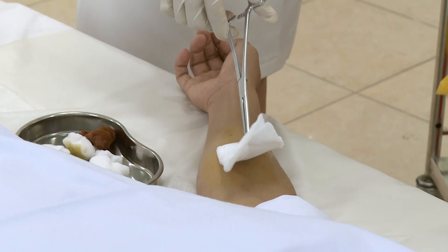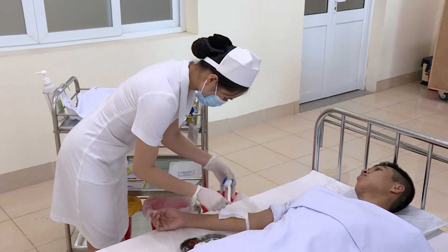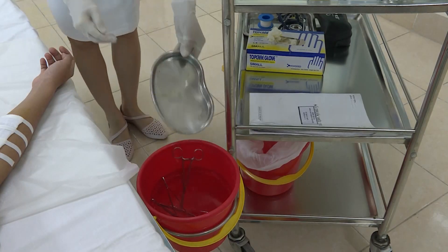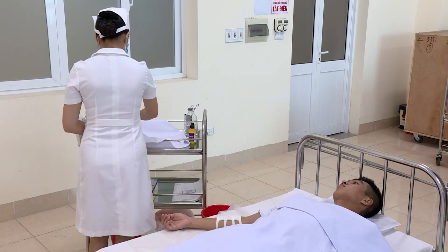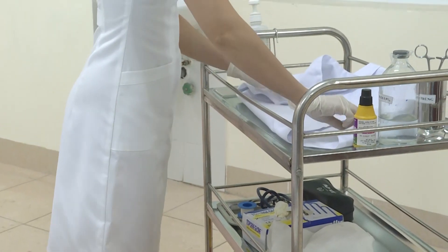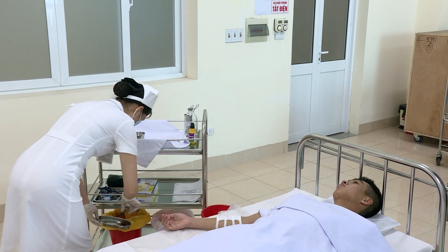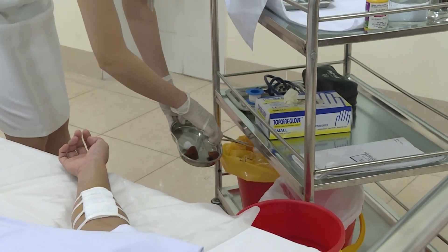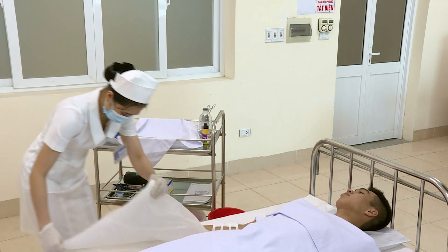Dùng kẹp gắp gạc vô khuẩn đặt lên vết thương đã được sát khuẩn. Dùng băng dính băng lại. Cho dụng cụ kim loại đã sử dụng vào chậu đựng đồ bẩn để ngâm khuẩn. Thu dọn dụng cụ. Cho bông, băng, gạc đã sử dụng vào sô đựng chất thải lây nhiễm. Thu dọn tấm ni lông trải dưới vùng thay băng.